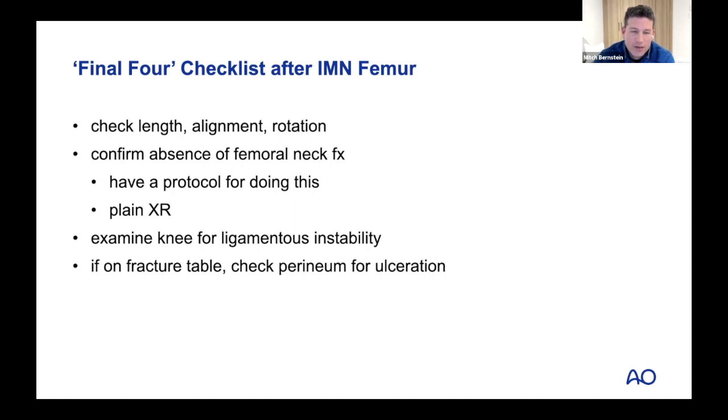Yes, a sterile X-ray. It's not a whole femur X-ray. It's an X-ray of the distal femur, with the beam centered at the knee, and then I'll measure the angle between a tangent across the distal femur and up the axis of the nail, because the nail will be a surrogate for the anatomic axis of the femur. It's supposed to be about 81, 82, 83. And if it's grossly abnormal, then I'll pick a strategy to block the path of the nail and realign it.